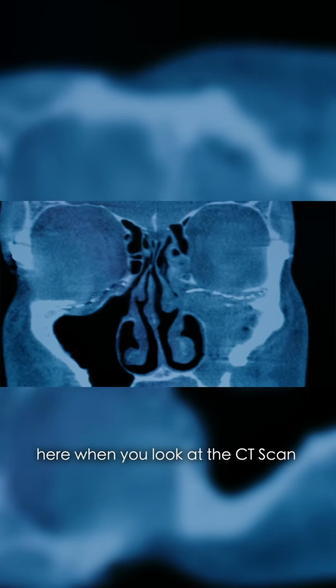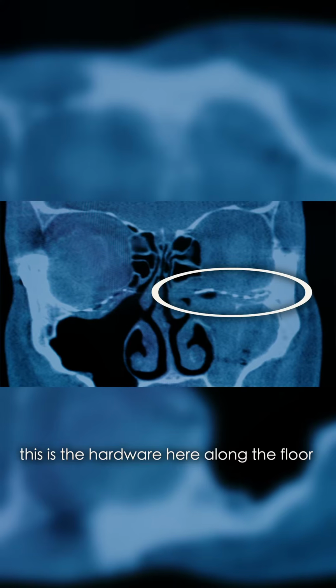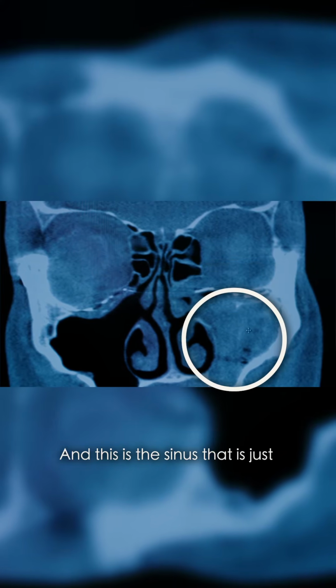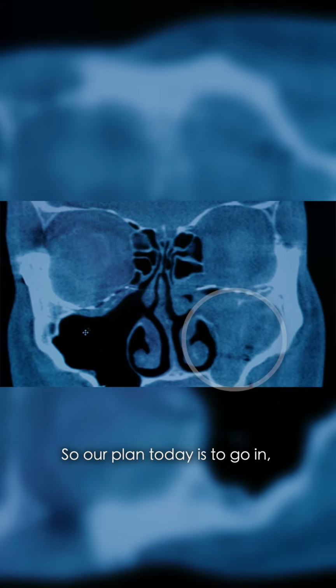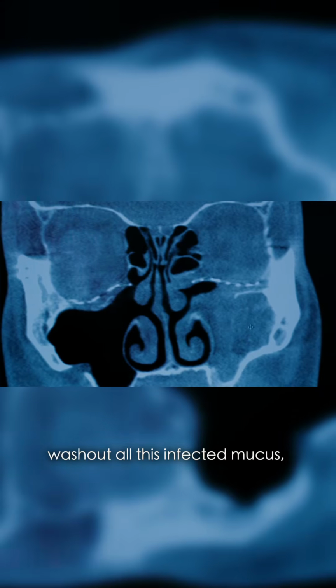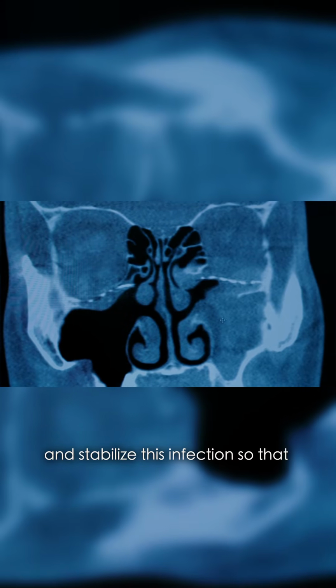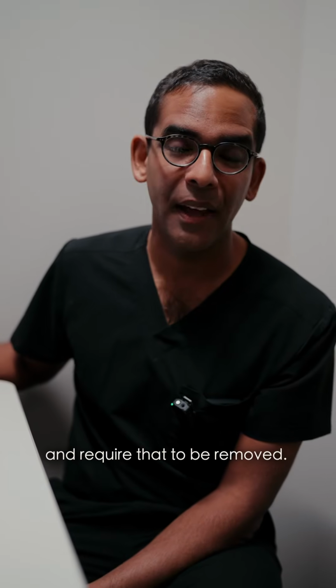And you can see here, when you look at the CT scan, this is the hardware here along the floor of his orbit. And this is the sinus that's just completely filled up with mucopurulent discharge. So our plan today is to go in and open up this sinus cavity, wash out all this infected mucus, and stabilize this infection so that it doesn't ultimately impact his hardware and require that to be removed.